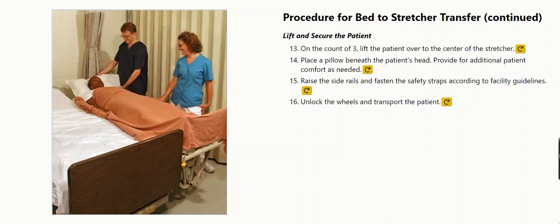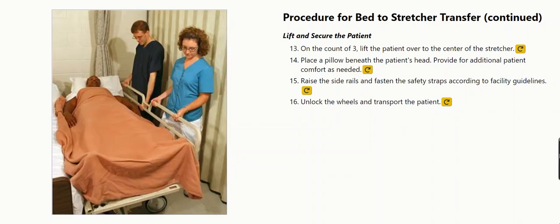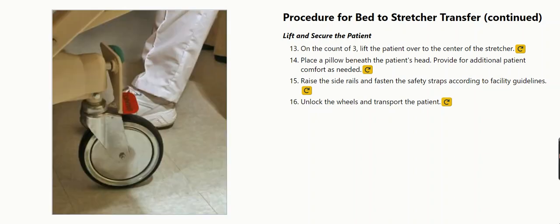Provide for additional patient comfort as needed. Raise the side rails and fasten the safety straps according to facility guidelines. Unlock the wheels and transport the patient.